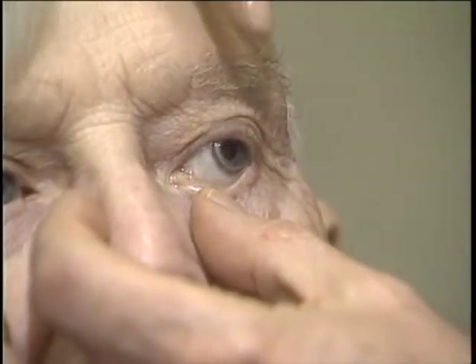For the strongly blinking patient, the medial parabulbar injection is done as the primary block. This spreads into the lids, giving excellent lid akinesia. Following which, the inferotemporal retrobulbar block can be done safely without putting the patient's eye at risk. Because we're working at the medial canthus, even if the patient is strongly blinking, the net result is that they are not disturbed at all.